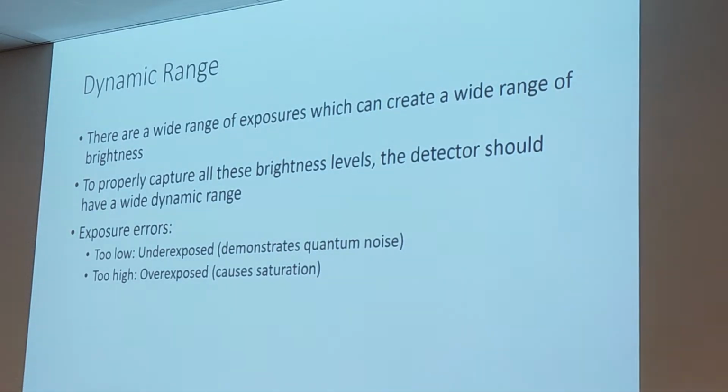And so that's why a lot of times you will see techs, when they select the knee, they'll go to the screen and they will decrease their exposure factors. They'll drop their mAs to avoid overexposing. Really common is just using a grid technique when you don't have a grid. It causes overexposure.